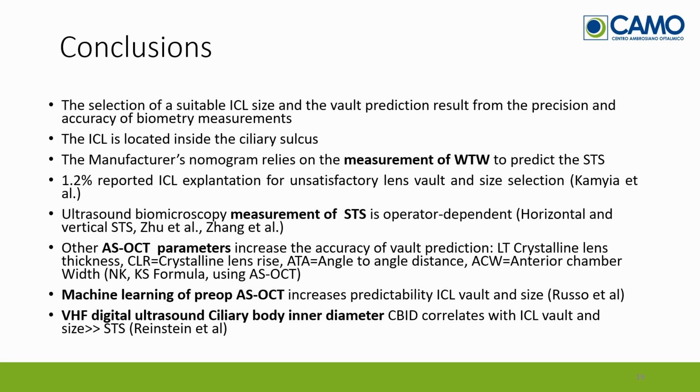And we know that ultrasound biomicroscopy, measuring the sulcus to sulcus distance directly, has a very high reliability in terms of postoperative vaulting. However, ultrasound biomicroscopy is a difficult technique, not available in every clinic, and is very much operator dependent. Anterior segment OCT has offered many parameters, and there are formulas described using many other parameters, the NK, the KS formula, and these have increased the accuracy of vault prediction.